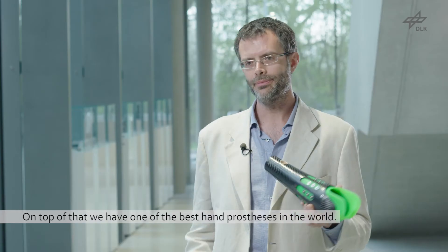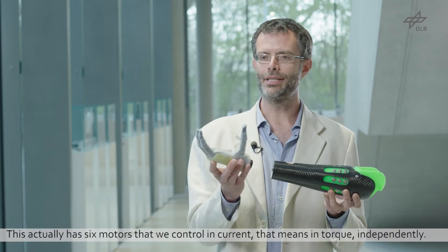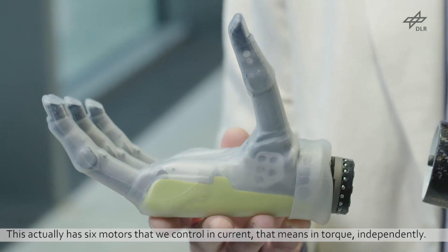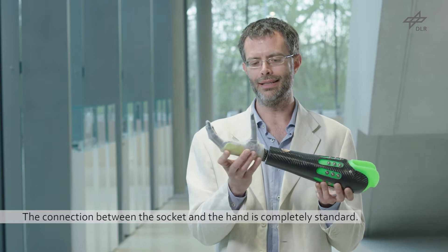On top of that we have one of the best hand prostheses in the world. It has six motors that we can control in current — that means in torque — independently. The connection between the socket and the hand is completely standard.